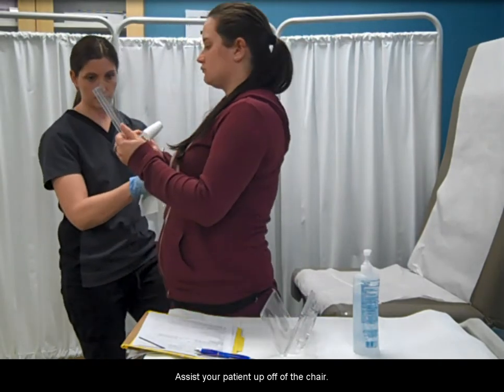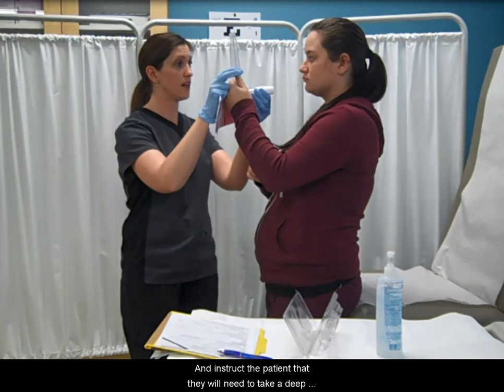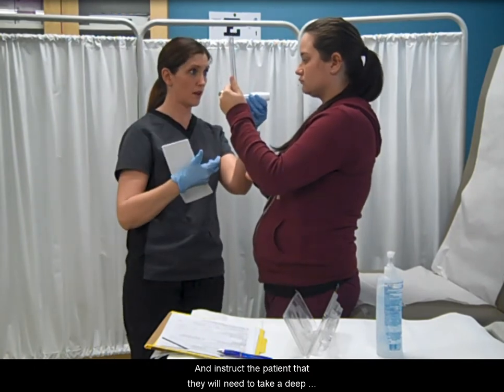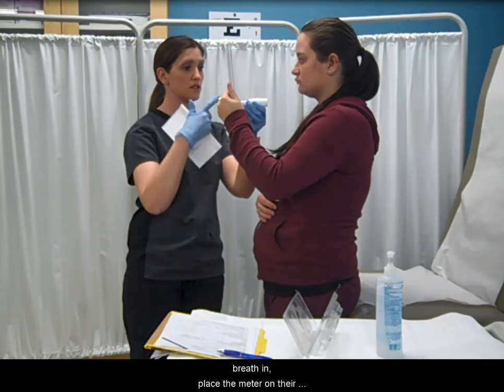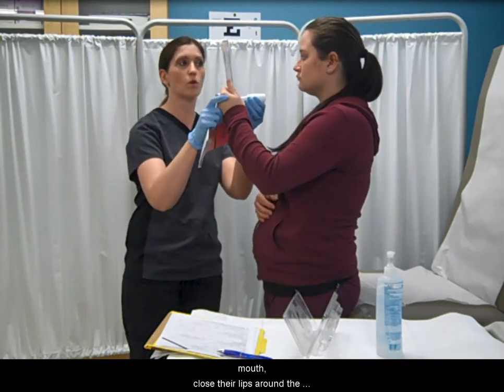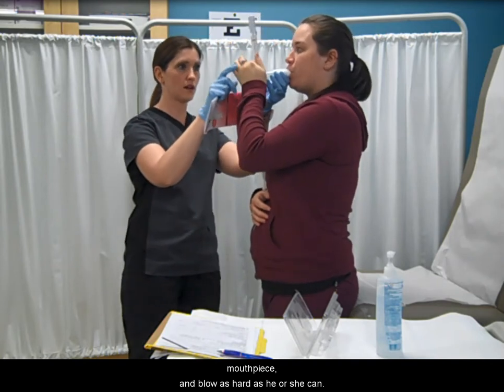Assist your patient up off of the chair and instruct the patient that they will need to take a deep breath in, place the meter on their mouth, close their lips around the mouthpiece, and blow as hard as he or she can.